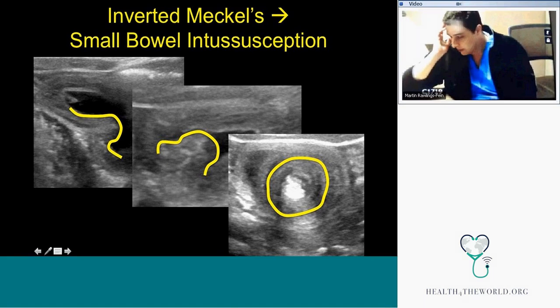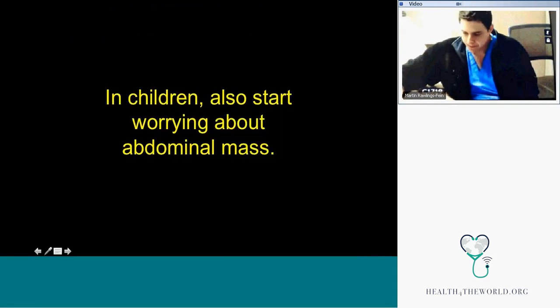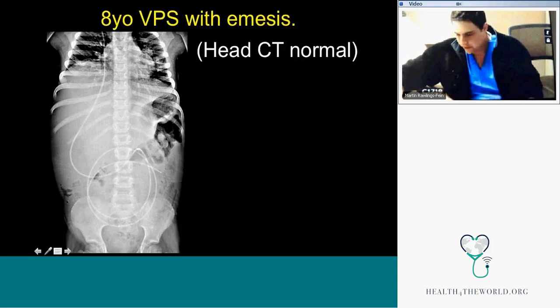So I said small bowel intussusception can mostly be ignored unless it's causing obstruction. And if you see this sign, where the bowel is actually getting intussuscepted from this infolded tissue here, start worrying about tumors and other mass effects in kids. So let's see examples of that.